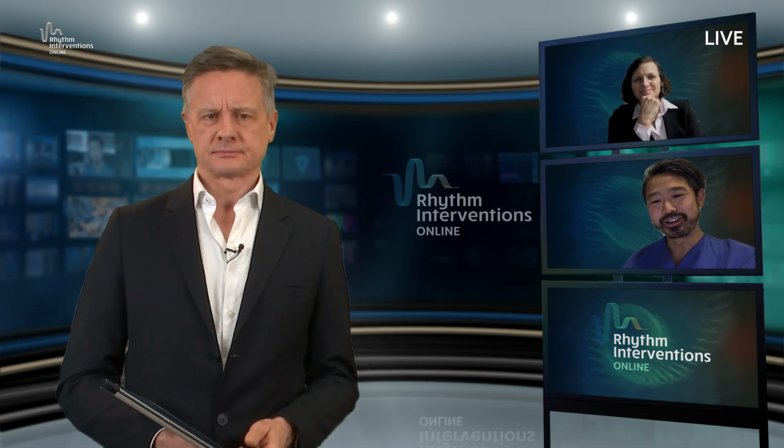It's always too early to tell if you talk about new technology and new strategies, of course. But from my current understanding, if I look at it from a more global perspective, I believe that an anatomic device, maybe the cryoballoon or any cryoballoon, is also proven and linked to a very high rate of durable pulmonary vein isolation, which is still at this point in time our best endpoint for the index AF ablation procedure.